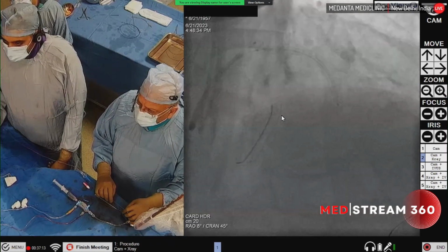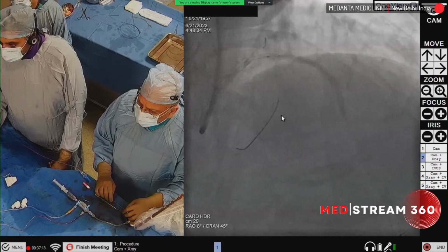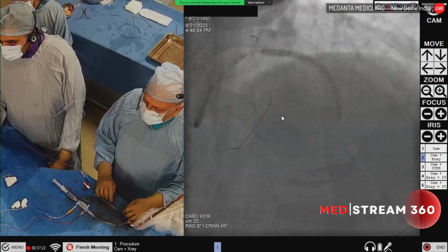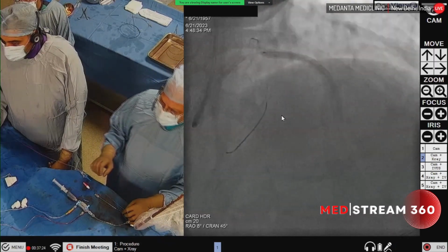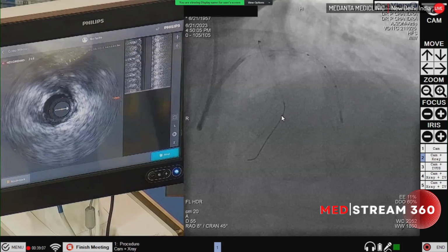Yes. Okay, and the nominal is, go up. 1, 2, 3, 4, 5, 6, 7, 8, 9, 10, 11. Okay, deflate. Okay, so pull back.